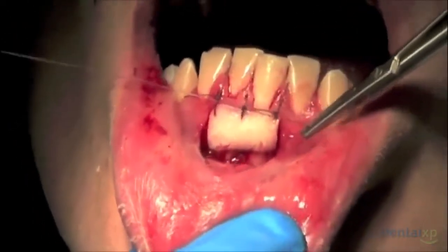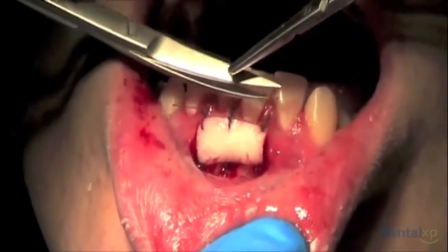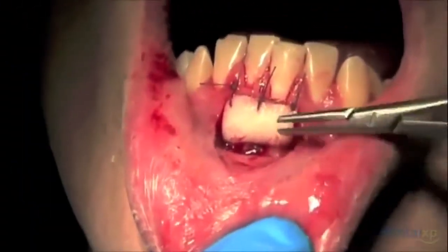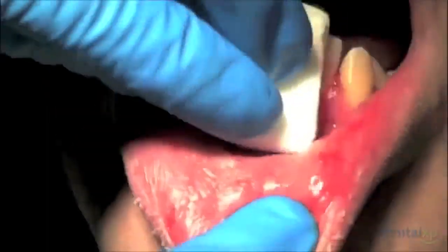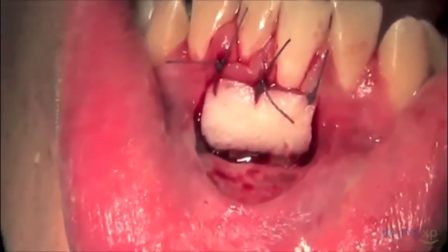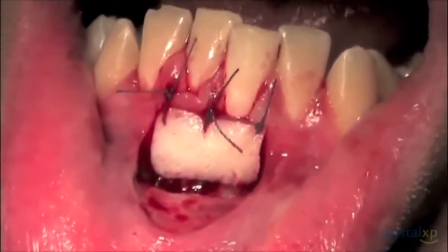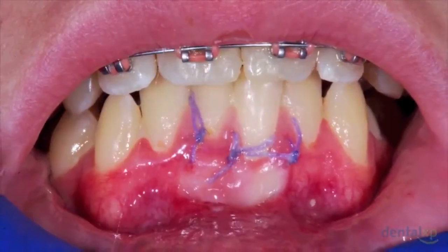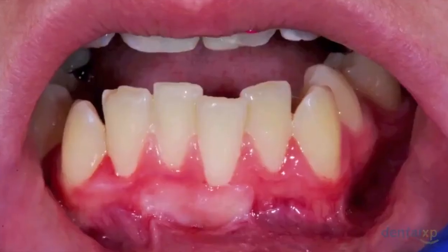The benefit of a free gingival graft, however, is that it gains large amounts of keratinized and attached gingiva, as well as permanently eliminates the frenum pull. The downside is that the color match is often inconsistent with the surrounding tissue compared to the other alternatives. The sutures are ready to be removed at 2 weeks, and by 3 months you can see the massive increases in the keratinized and attached gingiva, as well as the permanent elimination of the frenum attachment.